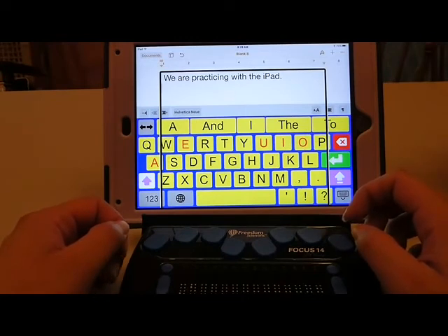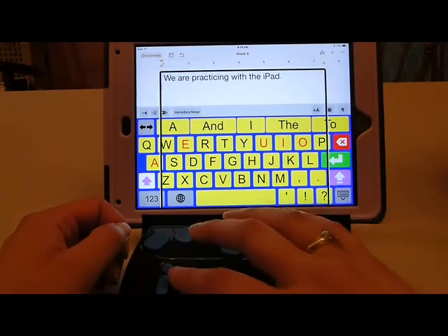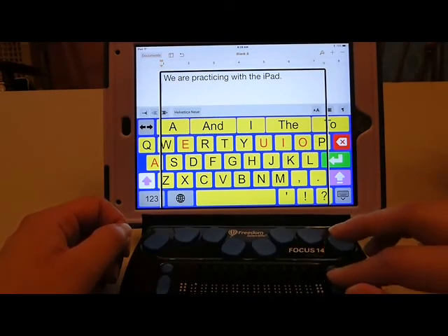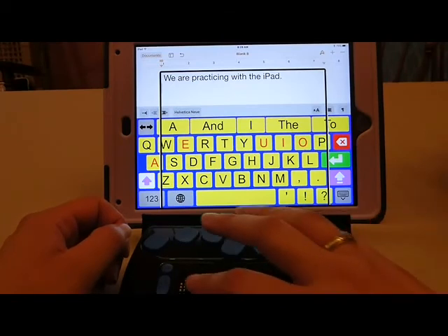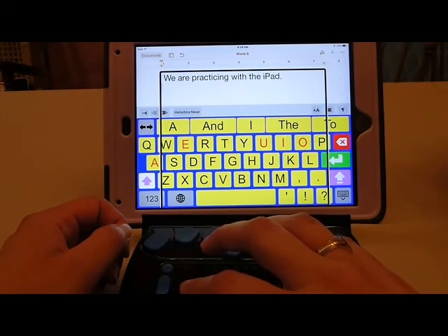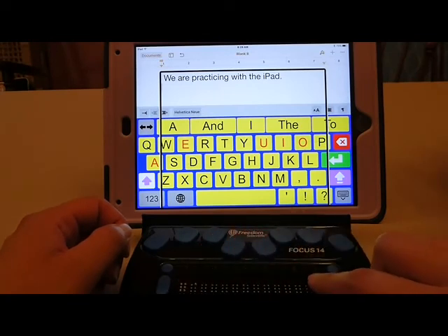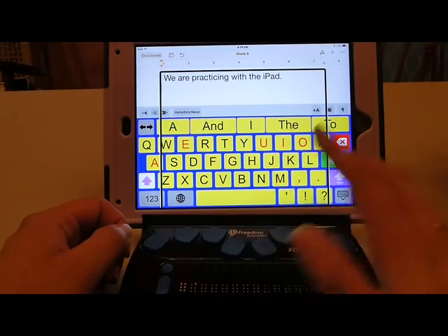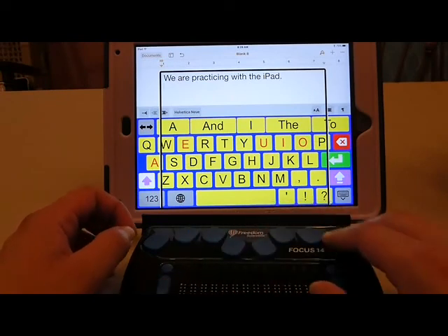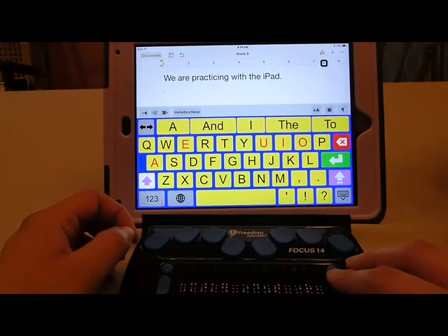Something that often comes up with students becoming frustrated is they accidentally start Brailling something — they inadvertently hit a dot and don't realize it, and now the iPad won't take their commands. It's not doing what they want. Well, it's not working because it thinks it's translating a word right now. So I always have my students, as the first thing if their Focus is not doing what they think it should be doing, double check whether there are full cells at the bottom. If there are, you just hit space to have it realize that you're no longer writing a word. Now it's ready to take commands and buttons the way you would normally expect.